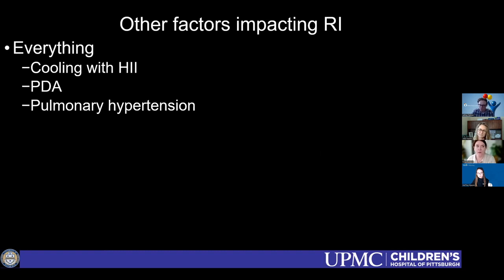So it's been very important for us to have a very standardized protocol so that all of our techs, no matter where they are in the city of Atlanta, give us the same information for every single baby. And it's just easier to get them to do it every single time.